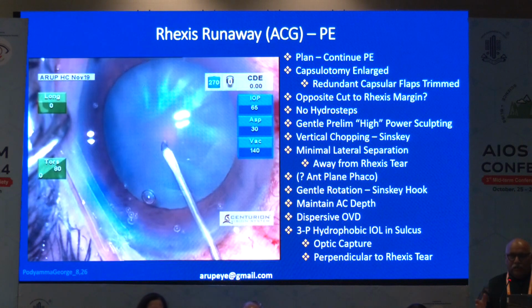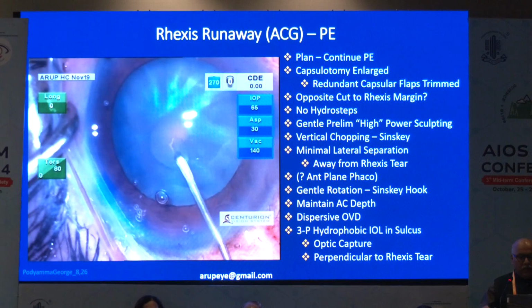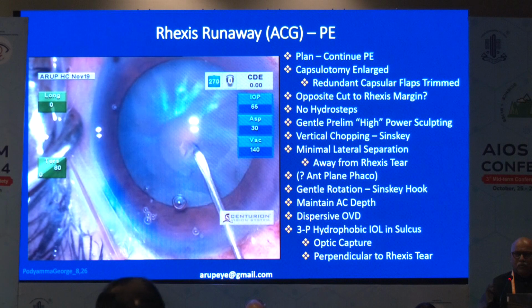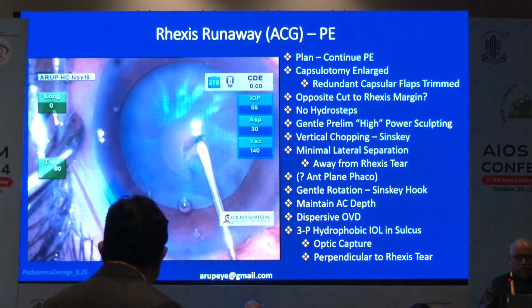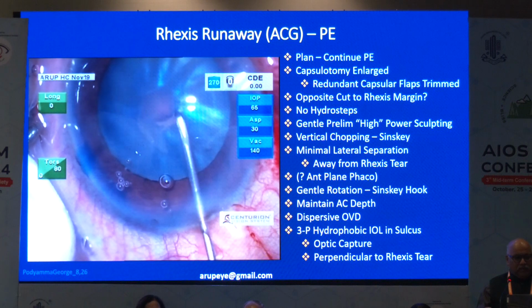Now I had used IV mannitol, a good digital massage. Such patients are always under peribulbar block, and the AC was shallow. It was an intumescent cataract. Pressure was in the mid-teens with all this manipulation. She was on 2 anti-glaucoma medications already. So here is the surgical challenge.